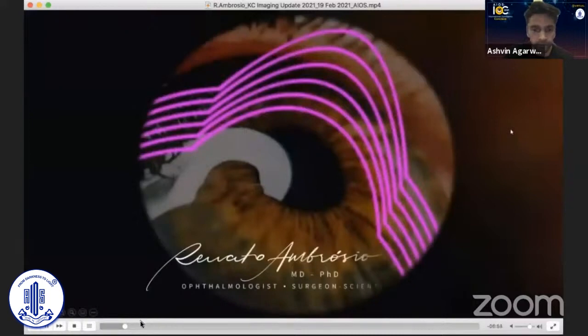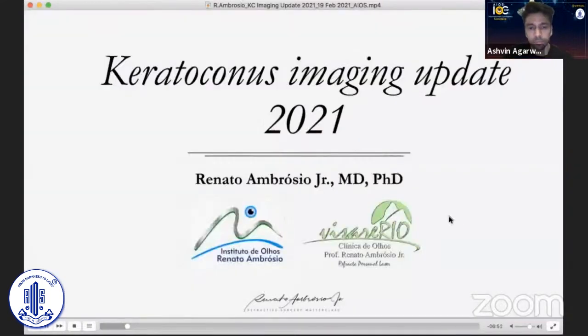One of my favorite topics is keratoconus imaging, and I'll give you a quick update in the 7 minutes.